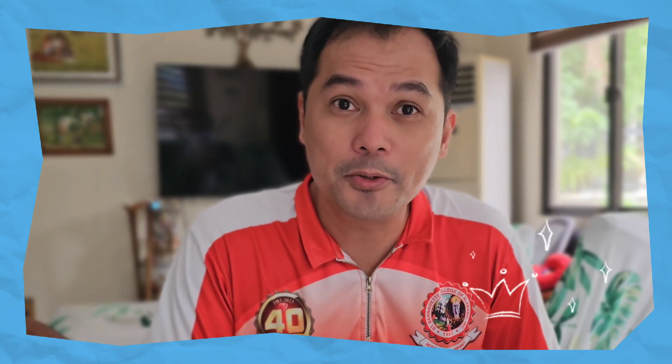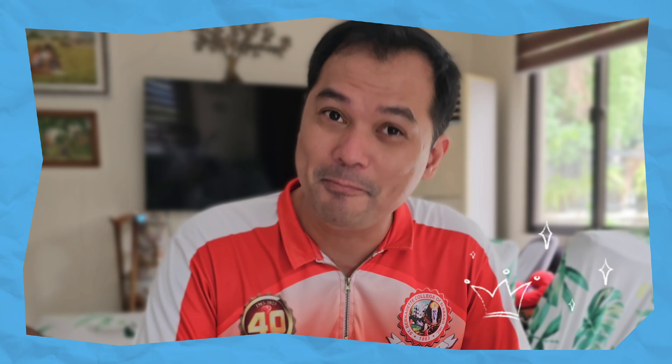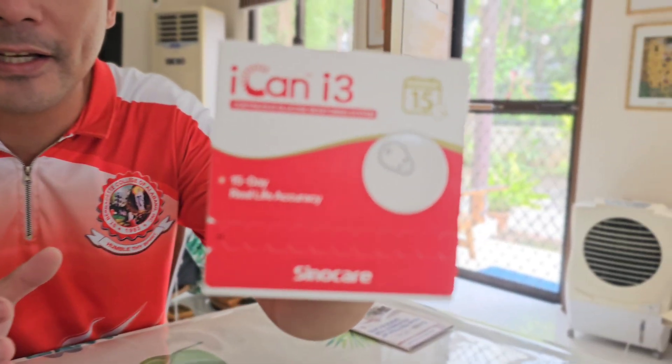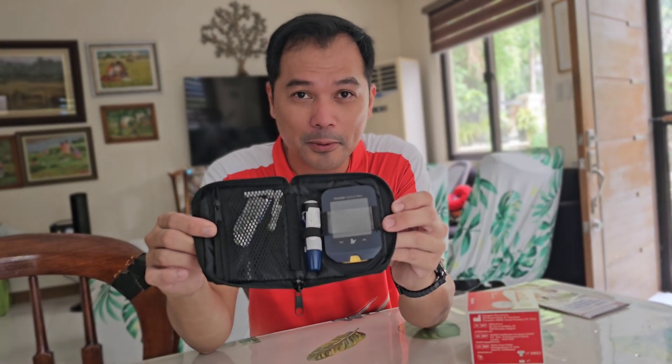Hey, what's up guys, welcome back to my YouTube channel and welcome to another video of tech and gadget unboxing. For this video, we're going to unbox and have a quick actual test of this SinoCare i3 continuous glucose monitoring system, because I have type 2 diabetes, and we're going to compare it with the traditional glucose test. Okay, let's go.